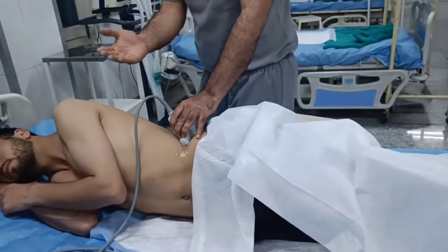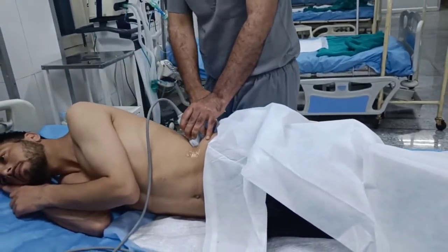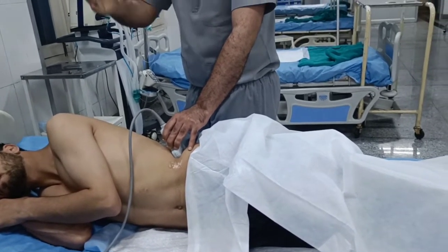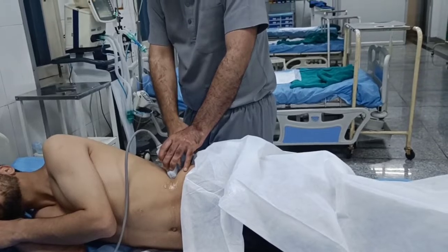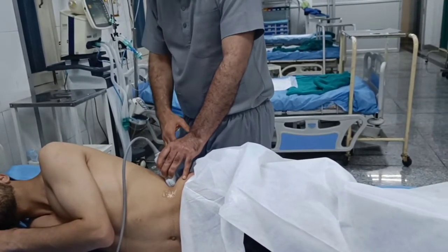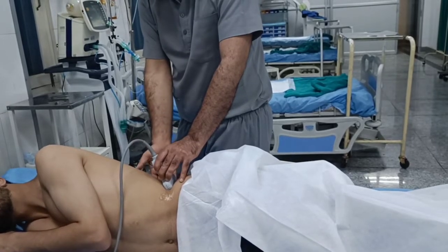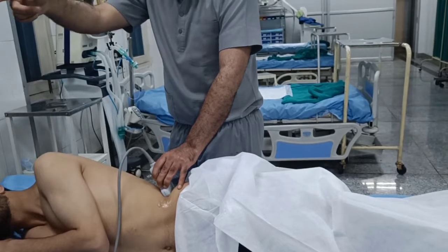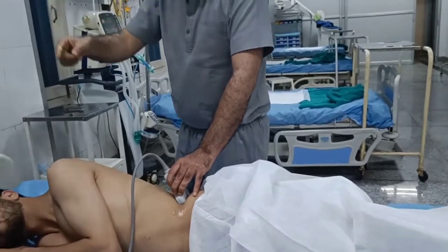Usually the beam goes like this. You have to see the distance to where the lumbar roots are, and according to that distance from the probe, you put your needle in the skin. Usually it should be 3 to 4 centimeters from the midline. Can you freeze that one? Can you show the monitor?